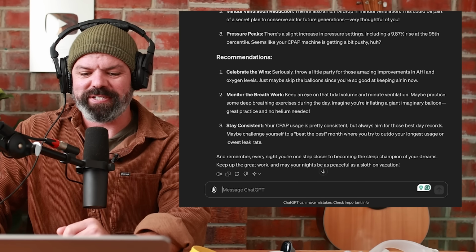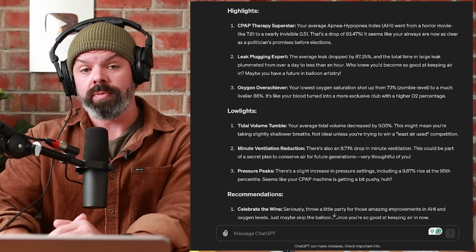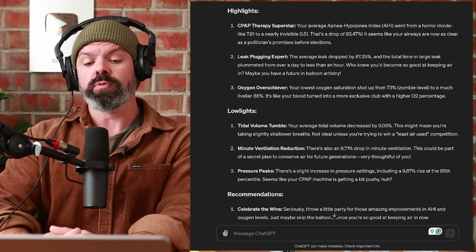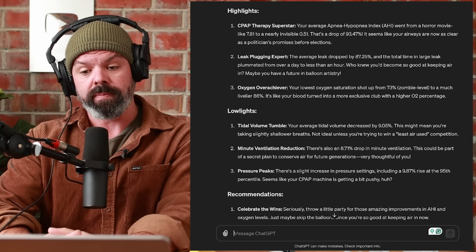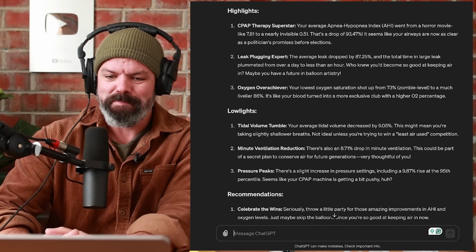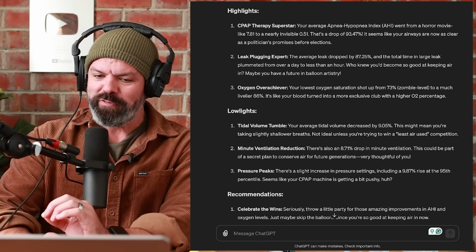All right, let's go through some of this for a bit of fun. Highlights. Number 1, CPAP therapy superstar. Your average AHI went from a horror movie like 7.81 to nearly invisible 0.51. That's a drop of 93.47%. It seems like your airways are now as clear as a politician's promises before elections. Not bad. Hopefully it gets a little funnier.